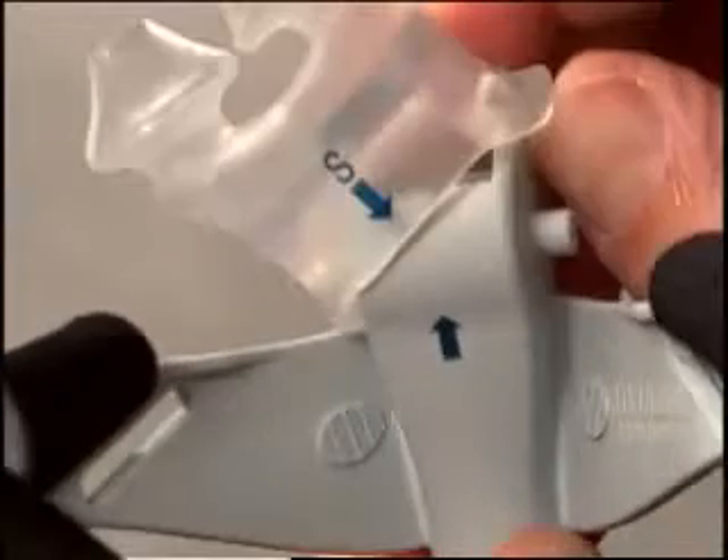To remove the cushion from the hub, grasp one side of the cushion below the attachment post and carefully peel it off.